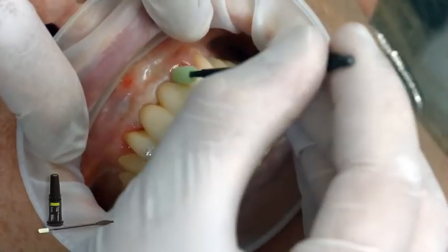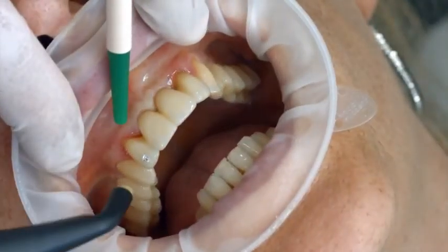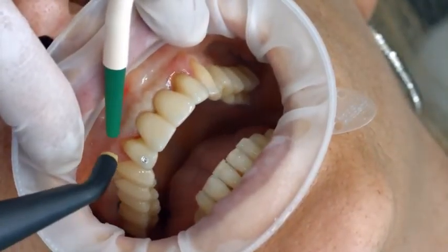Finally, apply a thin layer of floor protector with a Viva brush or a brush. Disperse the varnish with the air gun and dry it.